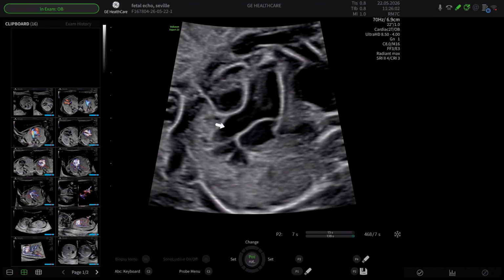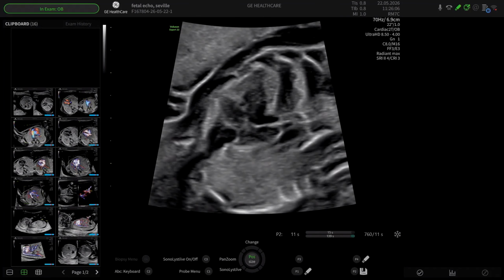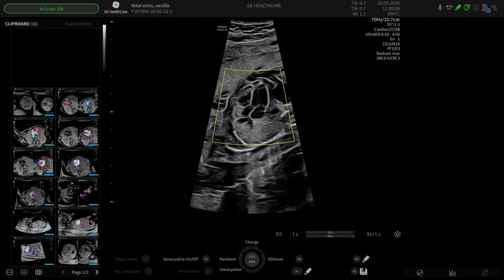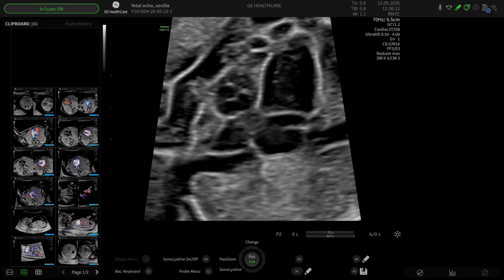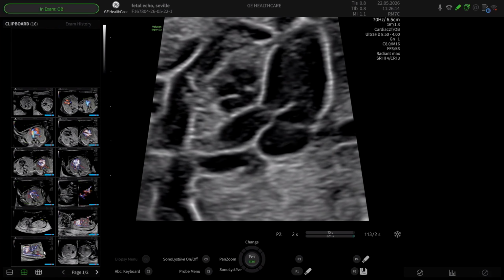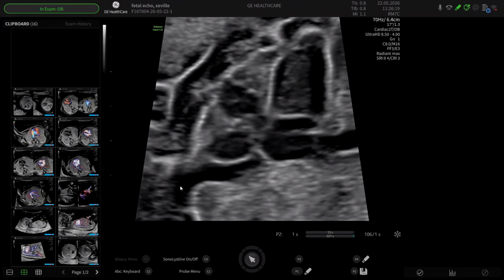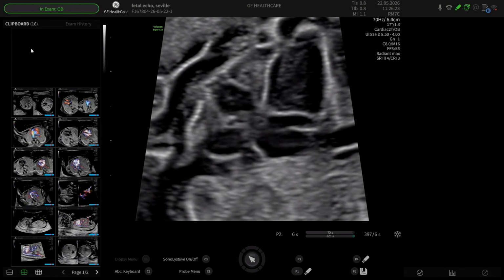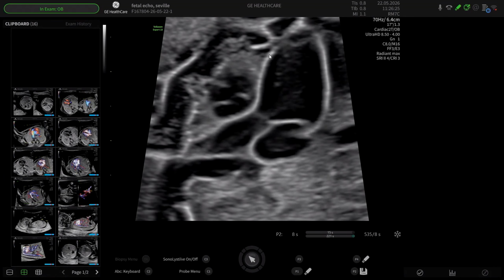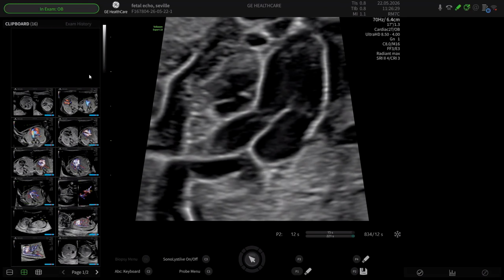I rotate my transducer from that to the left ventricular outflow tract. I then come down again, all the way through every cardiac imaging. You will see that I magnify the structure that I'm looking at. You can see the slight dilatation after the aortic valve. This is where the valves nest after they open, and that's completely normal. It's important to see the continuity of the interventricular septum with the anterior wall with the aorta.